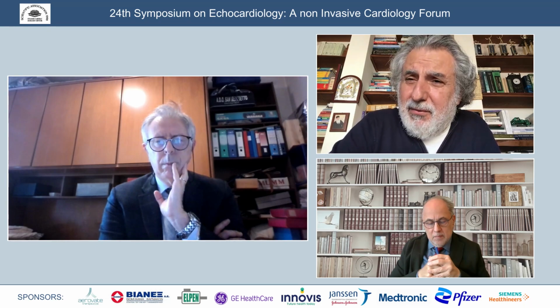Do you think that understanding the mechanism of prosthetic valve dysfunction, thrombosis versus pannus, and the degree of each mechanism will give a direction to how the drugs might be beneficial, and make patients more compliant and persistent with anticoagulant therapy without being on Coumadin, irrespective of AF or not?